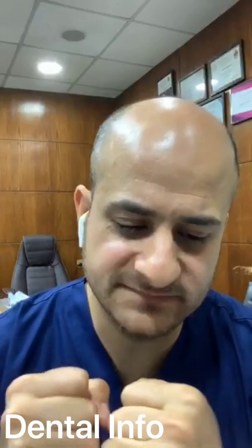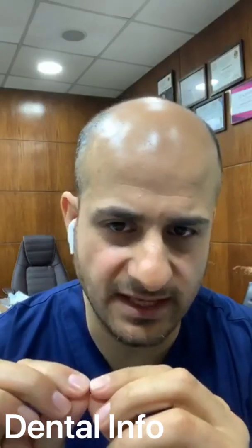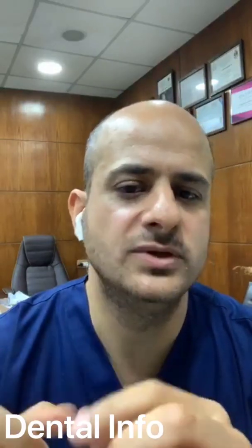What's the purpose behind clipping the end of the cone? Sometimes you have tugback, but you need it stronger. You can clip 0.5 or 1 millimeter from the cone, and you will have a better tugback.